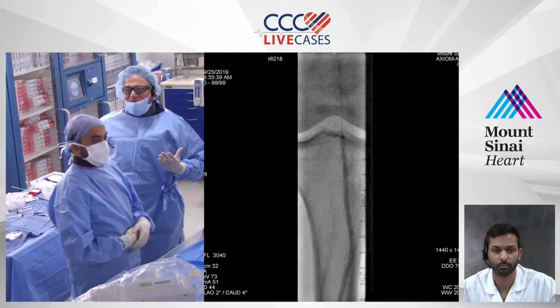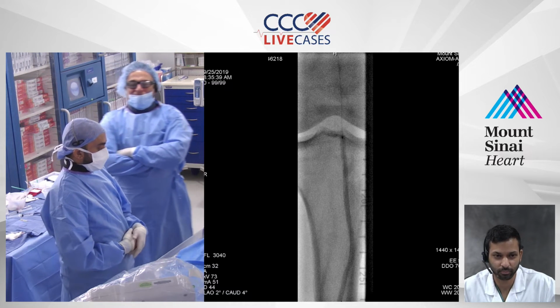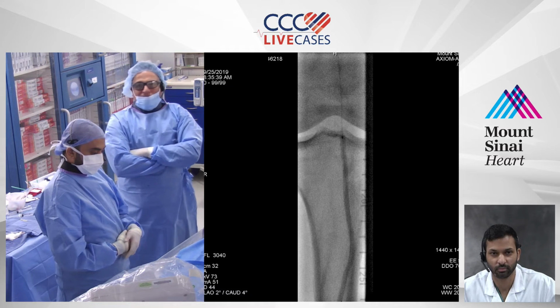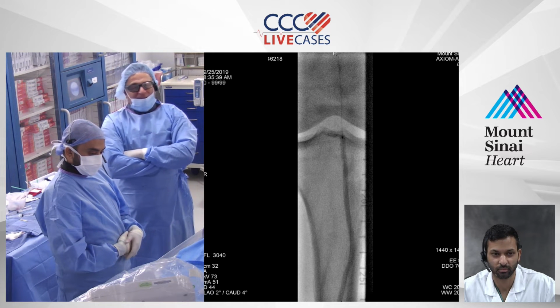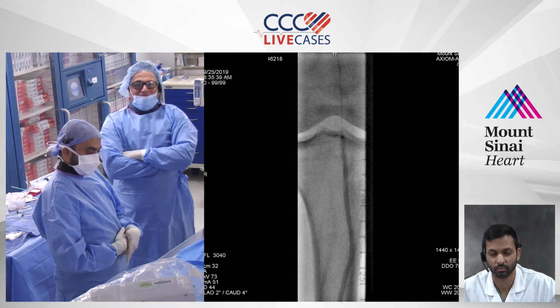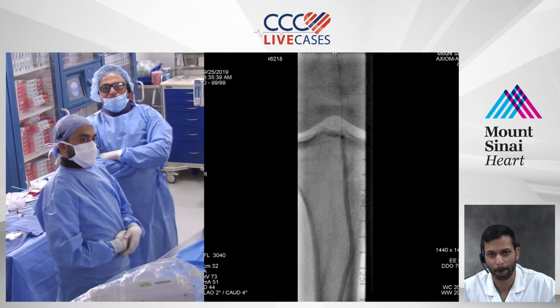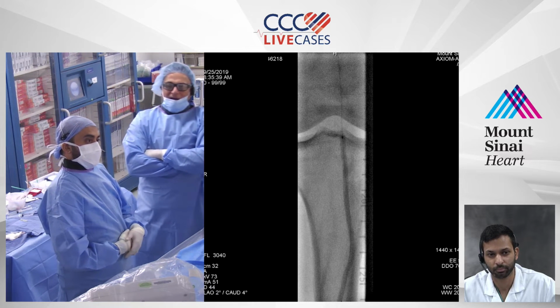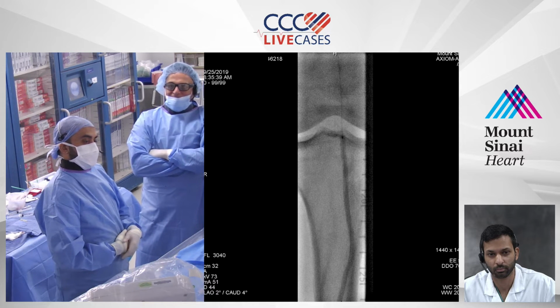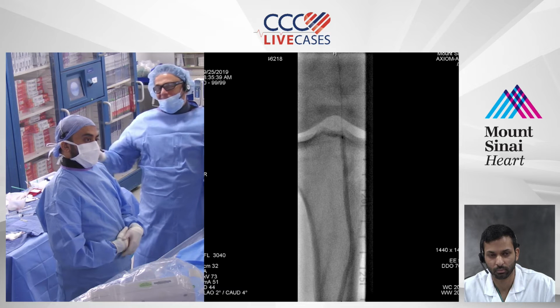Because as you and I know, algorithms are as different as us. You take some interventional cardiologists or surgeons, and they believe in stenting everything. You take some, and they say, oh no, just balloon it and leave it. Let's see how it does. And others will say DCB or drug-coated therapy is the way to go. So unfortunately, there's no consensus. But what I try to do is use logic and say, okay, listen, I don't think I have the holy grail here. Nothing is going to make this stay open for the next 10 years. And so my idea is, what's my next therapy? That's what I look at.